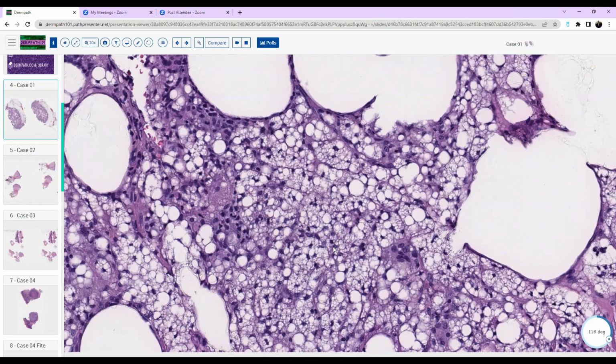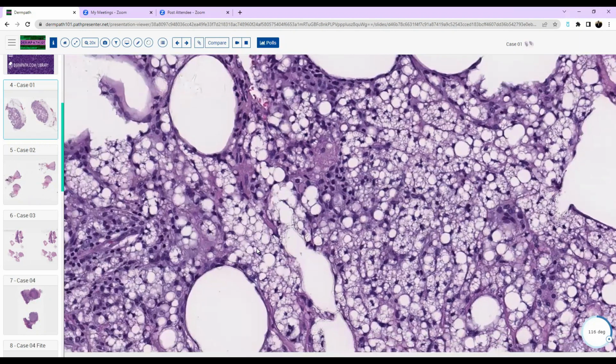Foreign bodies, I guess. Yes, foreign bodies can definitely do it. Sure. What kind of foreign material looks clear in the skin and has lots of little bubbles? Like filler or silicone. Silicone. Good. Silicone looks clear, and that's actually what this happens to be.